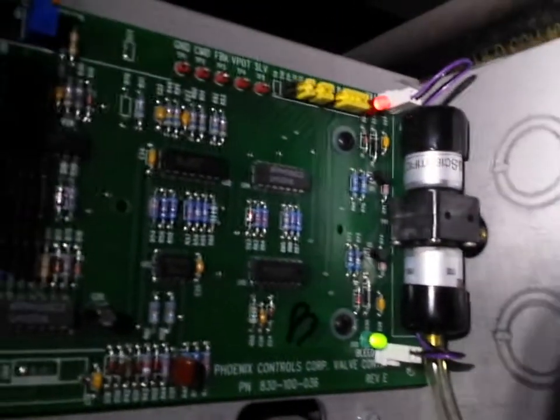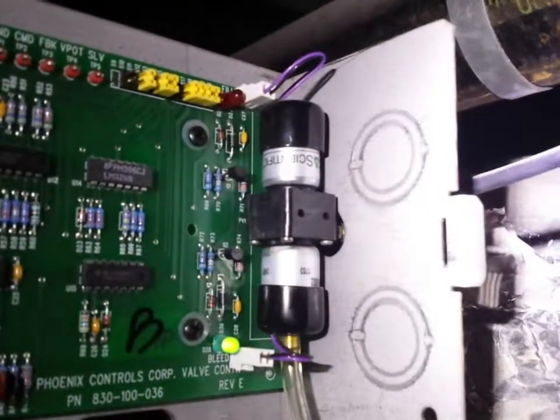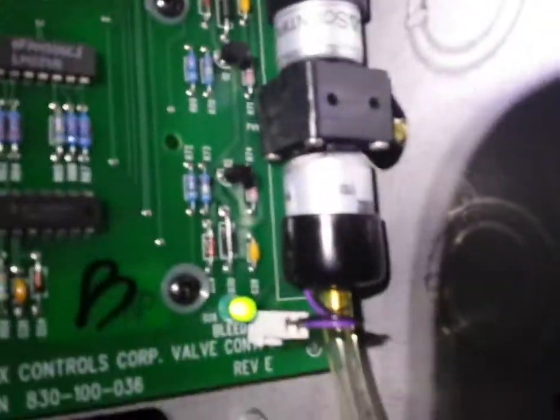If you've ever had to work on a Phoenix fume hood system and heard this annoying sound, this right here is the culprit. This air valve is very easy to replace if you follow a few steps.